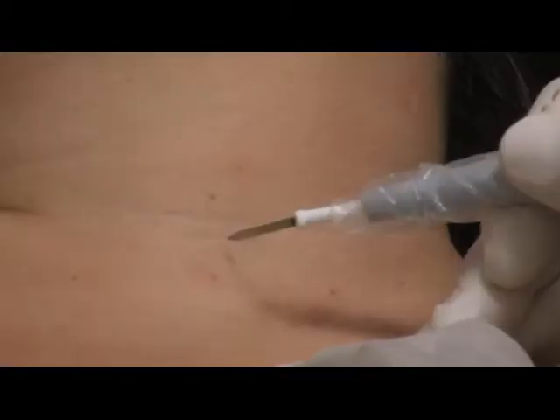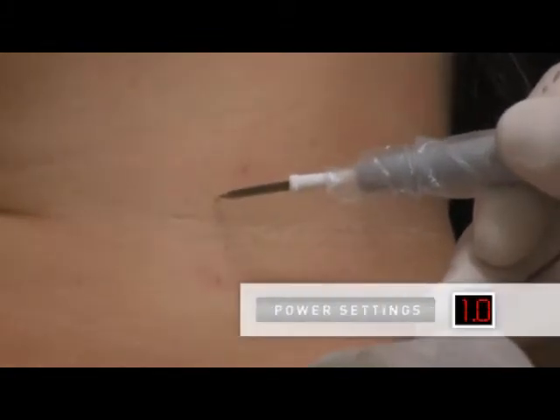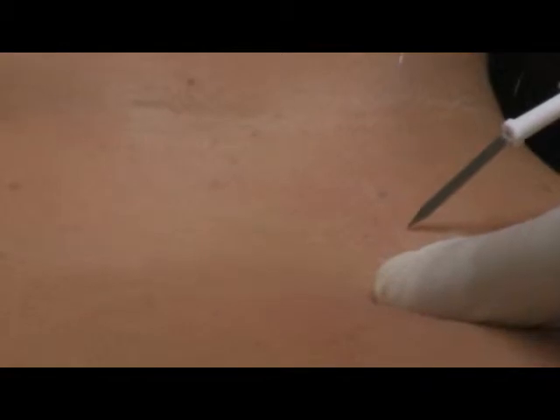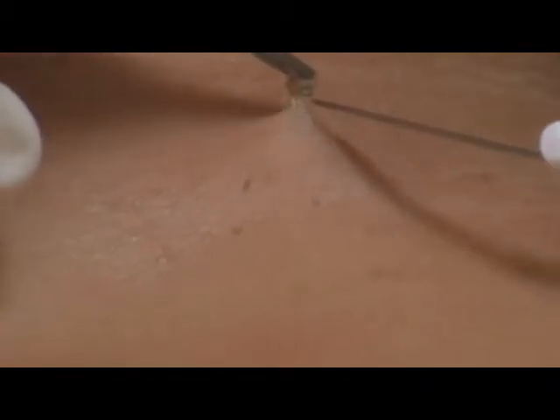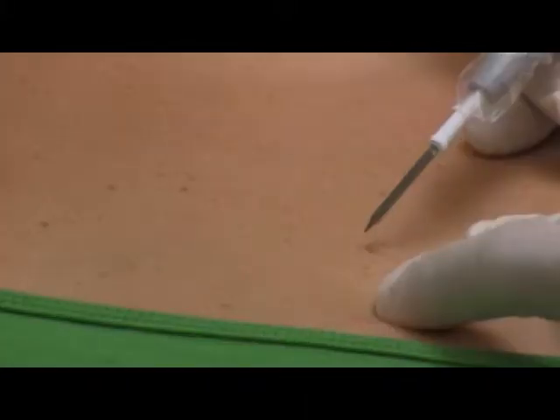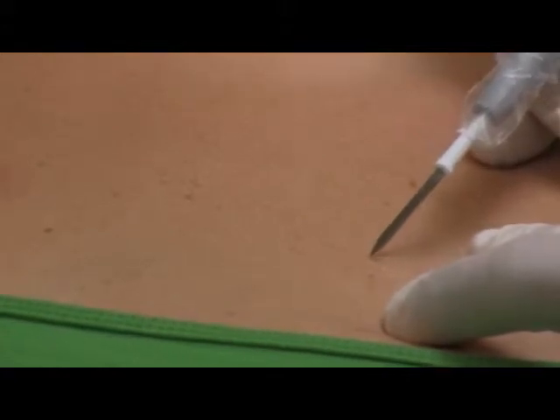To remove skin tags, we will electro-desiccate lightly at a power setting of 1 to 3 watts. A fraction of a second is all it takes and then the tag will blanch and can be removed. It is also possible to leave the tag and it will fall off in a few days. Here are a few examples of skin tag removal.